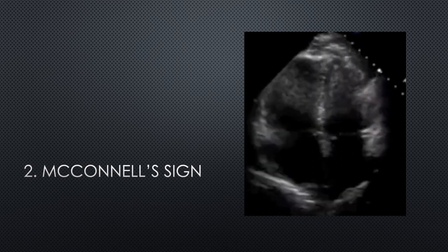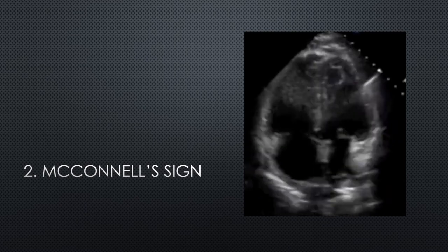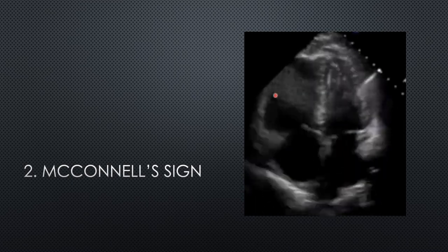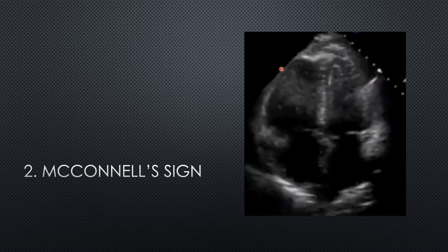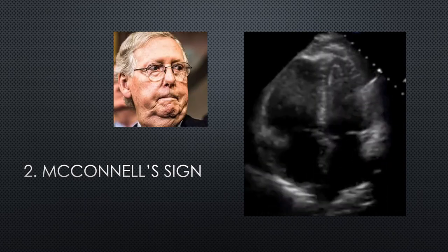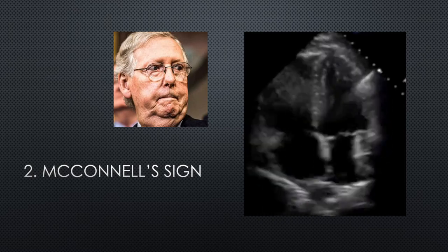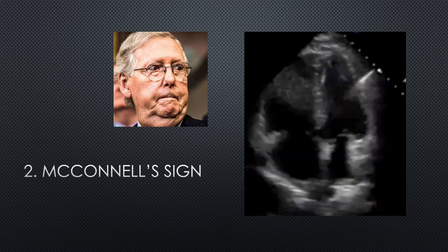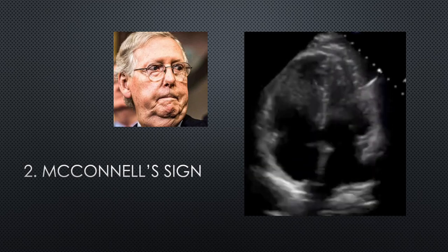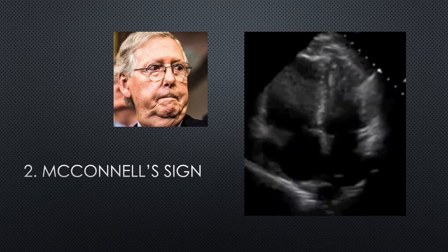The second thing to keep an eye out for is McConnell's sign — where you have RV dysfunction but sparing of the apex. In this image the free wall of the RV is hardly moving, but the apex is moving, winking at us. This is supposedly relatively specific for PE; it was described by McConnell in the 1990s as having a high specificity. Subsequent studies have shown it can occur in other conditions such as RV infarct or chronic pulmonary hypertension, but if you have a high pre-test probability of PE and you see this, it's very likely the patient has an acute PE.